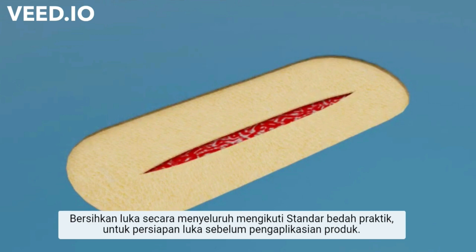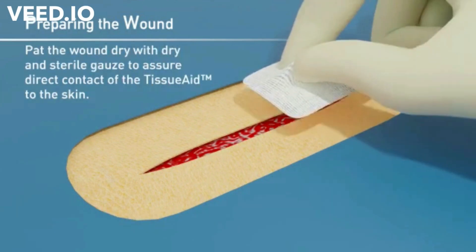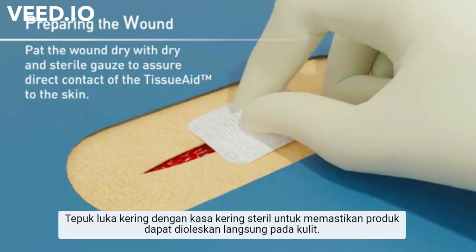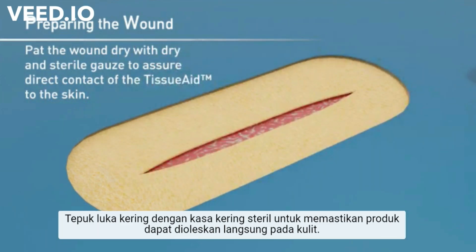Thoroughly clean the wound following standard surgical practice for wound preparation before the application of Tissue Aid. Pat the wound dry with dry and sterile gauze to assure direct contact of the Tissue Aid to the skin.